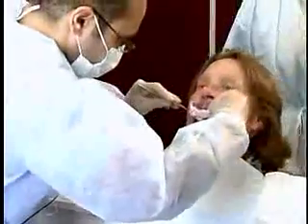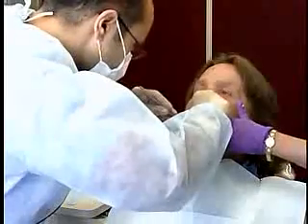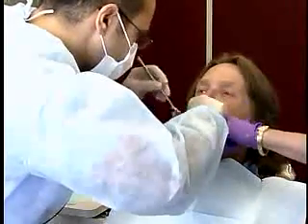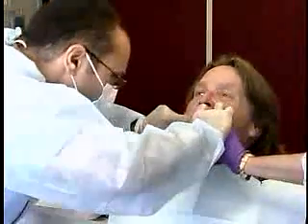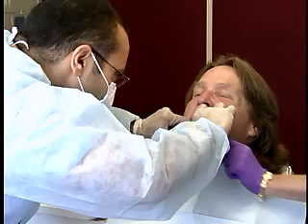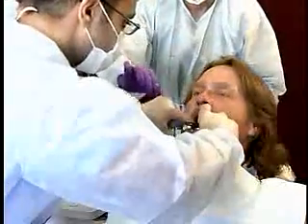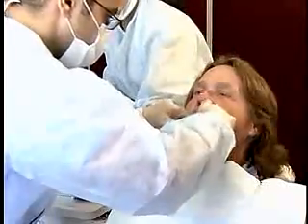Stand in front of the patient and place the tray at the left corner of the mouth. The right corner of the mouth is reflected with a mouth mirror. Center the tray over the residual ridge so that the tray handle is in alignment with the median line of the face. At this time, the lip is pulled out, so the alginate flows into the labial sulcus.